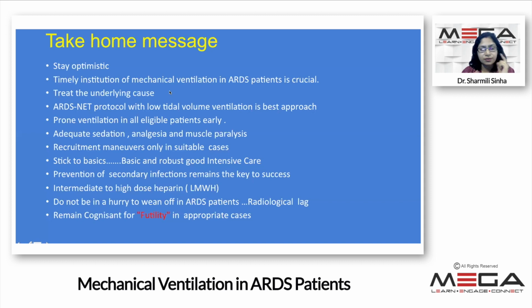Treat the underlying cause, be it pulmonary or extrapulmonary, as we saw in that list. ARDSNet protocol with low tidal volume ventilation is the best approach to start with, but do not remain confined to that. If your patient is not responding, then we have to change your management according to that list, and go for other alternative modes.